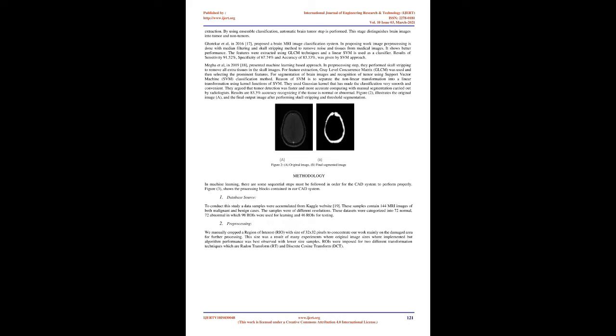A morphological operation was used to separate the tumor and the normal region. Features that are extracted are symmetrical, texture and grayscale, using multiple extraction methods like DWT, discrete wavelet transform, techniques. Support vector machine, SVM, classified the tumor as benign, malignant, or normal with an accuracy of 99%.